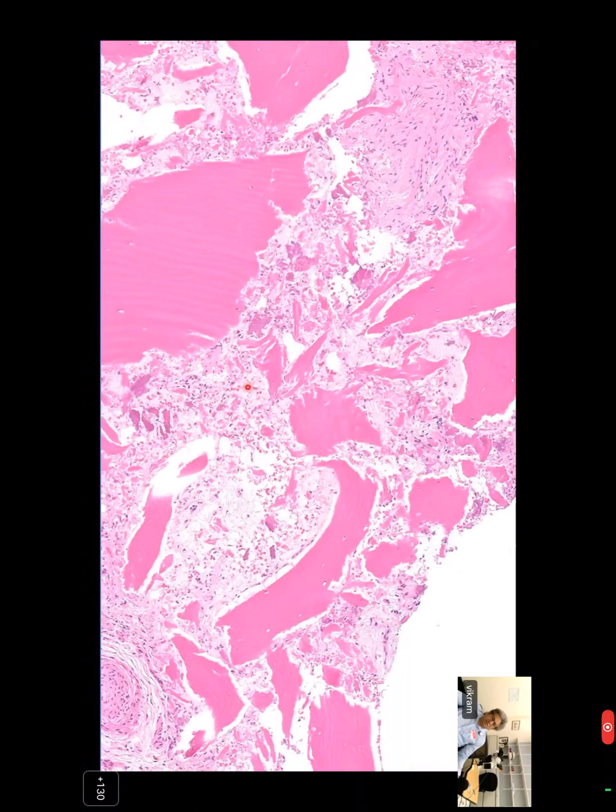This is lamellar bone, and there are no nuclei in it. Is this dead bone? I think that's one reason, the osteocytes are disappearing, getting sclerosed like the bone. The most common reason for osteocytes disappearing is over-decalcification. So this lay in decal solution for a little too long, and the nuclei disappear.